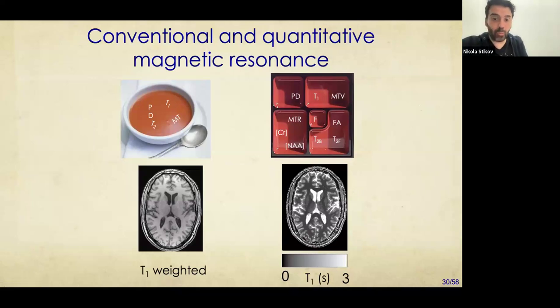And this enables you to perform the same measurement everywhere, all the time. And you can imagine that with the development of AI algorithms and all of these kind of automatic analysis of images, this kind of quantitative MRI approach would be very useful. So I would like to spend some time on how we can measure these parameters, how we can quantify them, and then we're going to talk a little bit about the way that we actually create the images, which has to do with the Fourier transform.